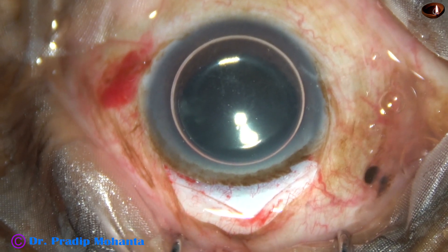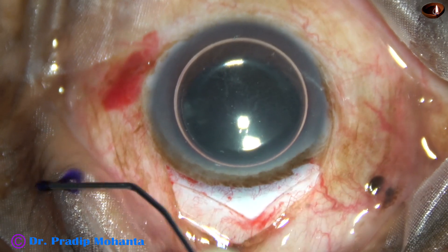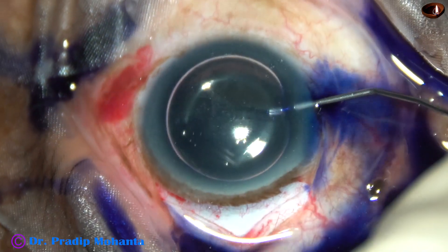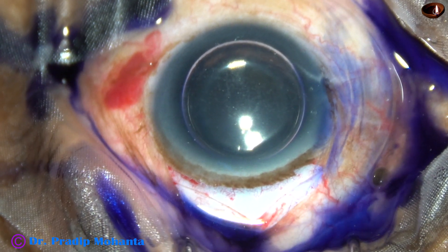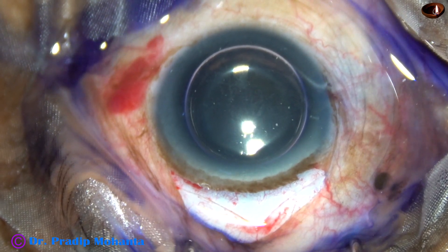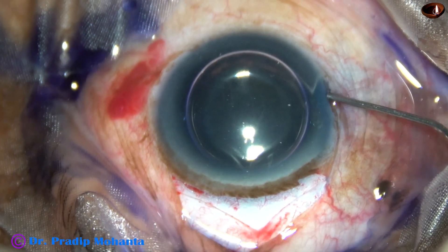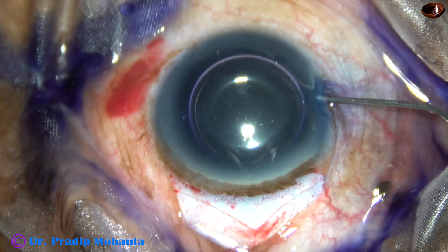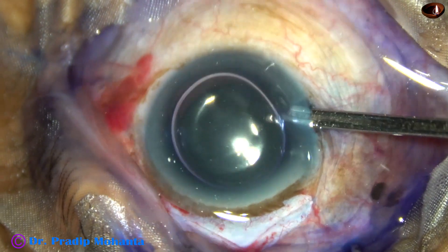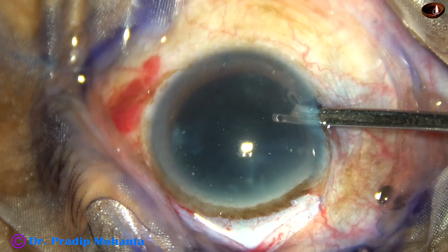The size of this paracentesis is about 1.8 mm. And now the anterior capsule is being stained with trypan blue dye. We will get some contrast if we stain the anterior capsule with trypan blue dye. This is a bit of adrenaline — this may help in keeping the pupil dilated during surgery. The dye is washed out.